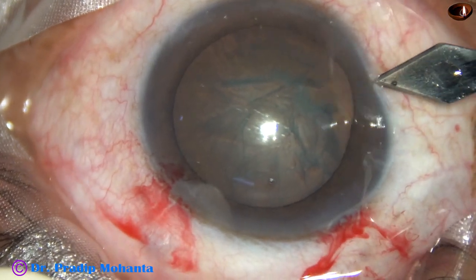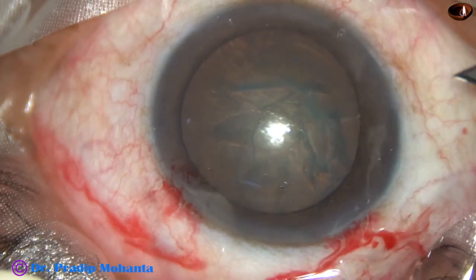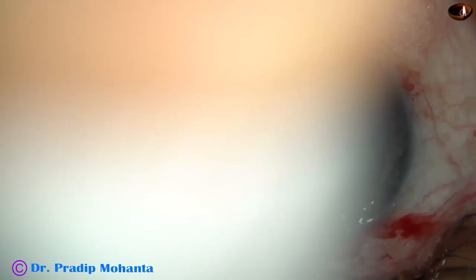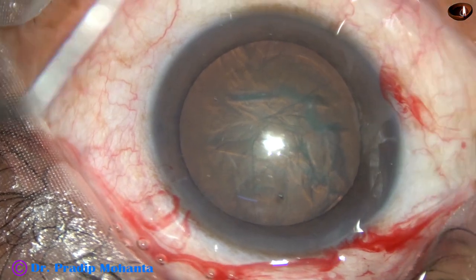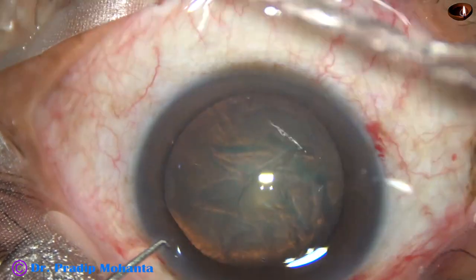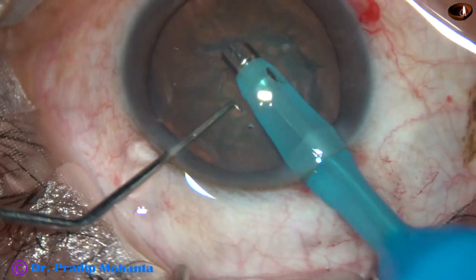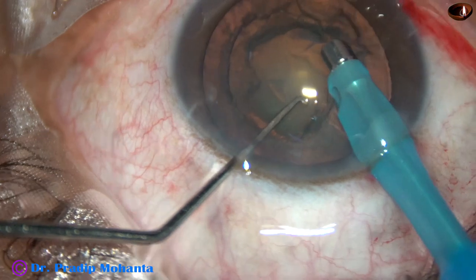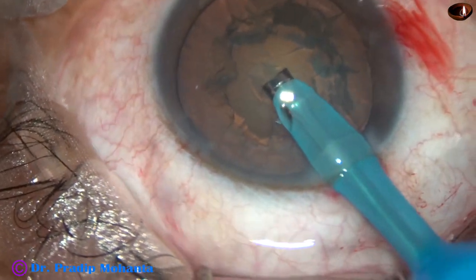One more side port is being made with the keratome because this is the left eye and the nose was obstructing the maneuver. The tip of the PHACO needle is introduced into the anterior chamber. This is the Faros from Oertli, Switzerland. Superficial cortical lens matter is removed. The handpiece is turned, bevel is up now.